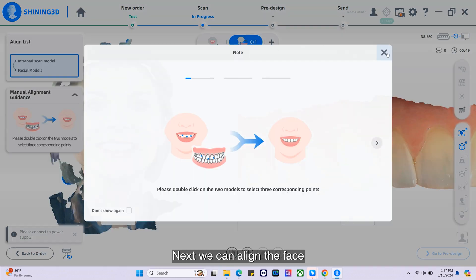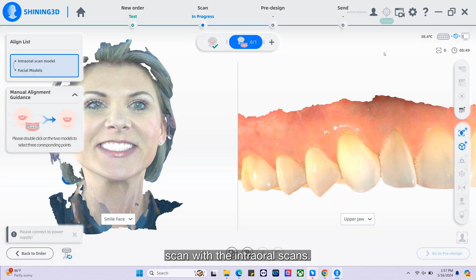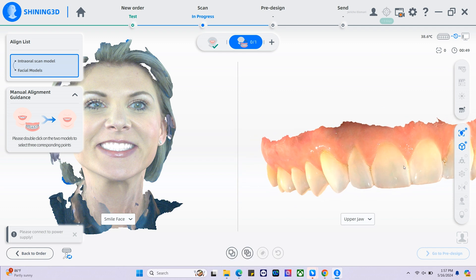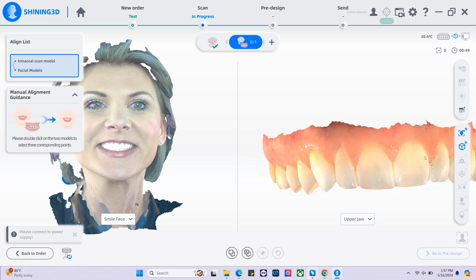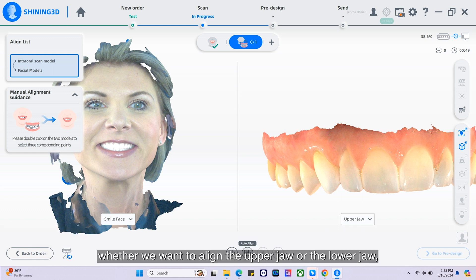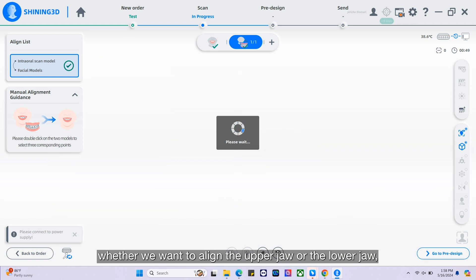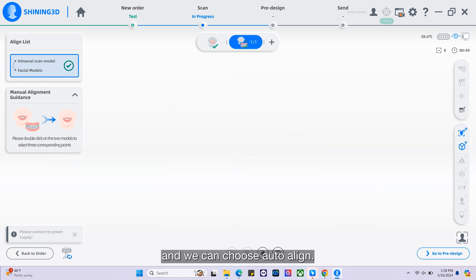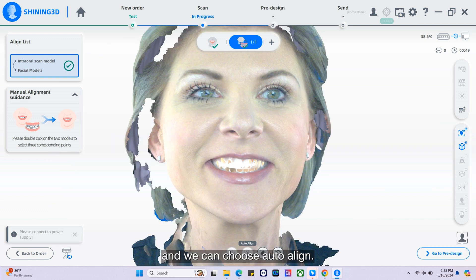Next, we can align the face scan with the intraoral scans. We can choose whether we want to align the upper jaw or the lower jaw, and we can choose auto align.